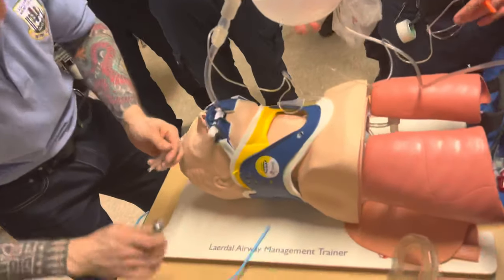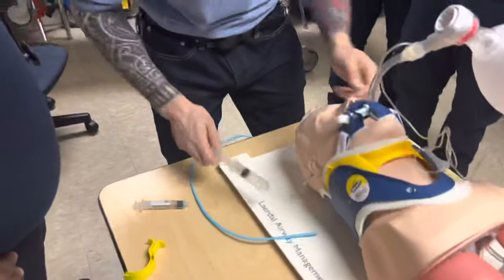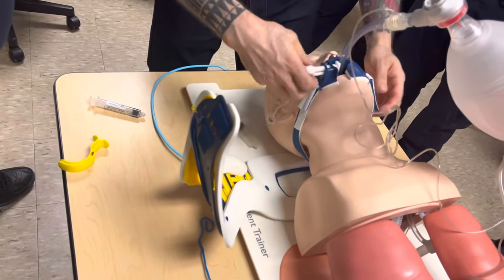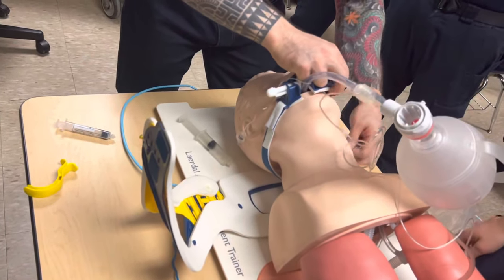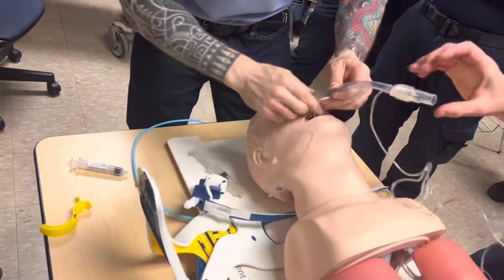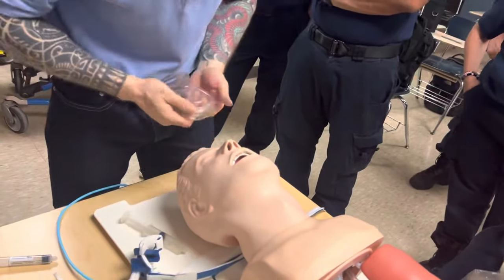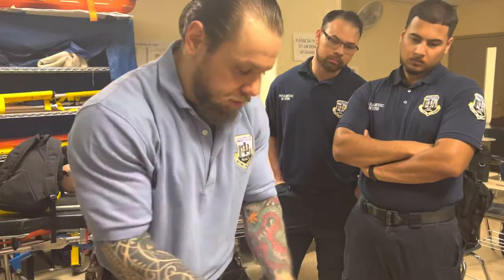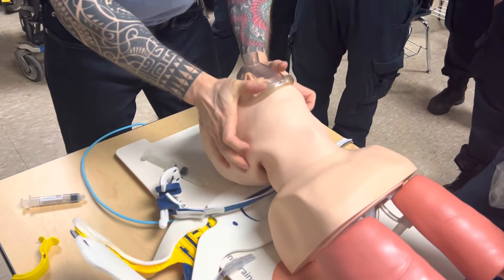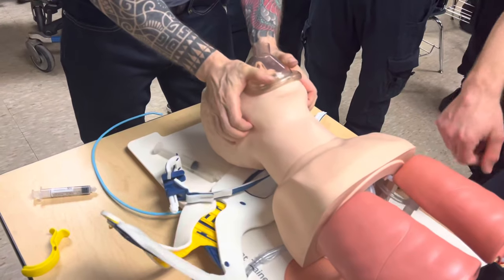If we needed to pre-oxygenate the patient - remember the triple airway maneuver I was showing you - we cannot do that because the cervical spine is involved. So we can only do the jaw lift. I'm going to show you a technique: connect the BVM.